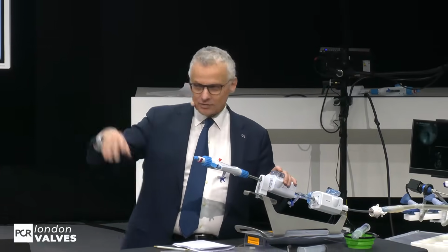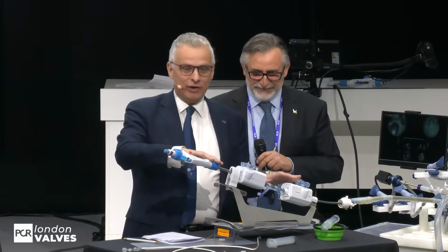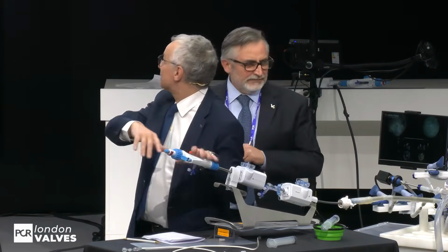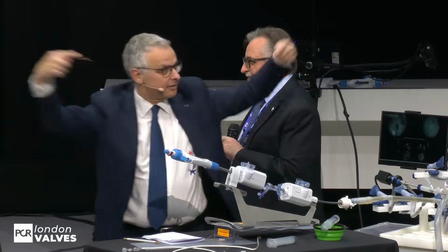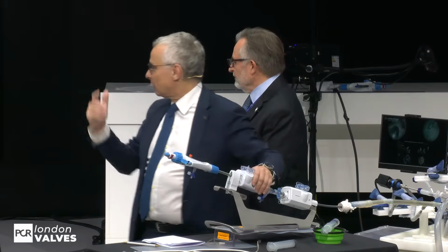Anyhow, this is the G5. Who knows G5 already here? Again, 2/3 of the audience, either you have a stroke or they don't have. If you have never seen G5, do we have a camera for us? Somebody can take my hands, to show the hands of the operator. There are no cameras here, so you watch here. It's okay, we don't have a camera. We didn't think about the boom camera.